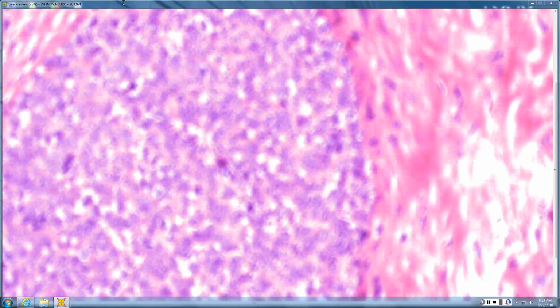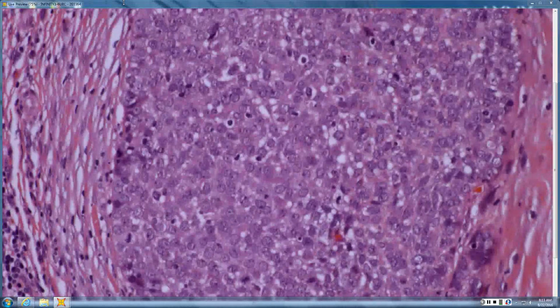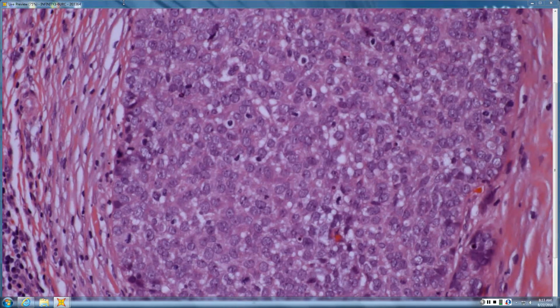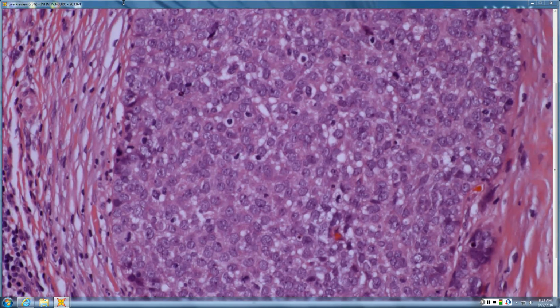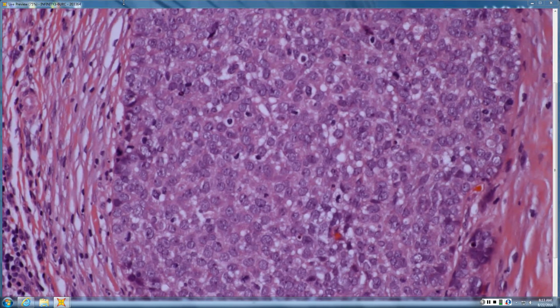Pretty large dermal tumor. I feel like a lot of pleomorphism and hypercellularity. Lots of mitosis, lots of visible nucleoli, irregularly shaped nucleoli with stems attaching them to the nuclear envelope, starfish-shaped nucleoli, very high nuclear cytoplasmic ratio. So you're pushing for something benign? Yeah, that was on the tip of my tongue. Yeah, so probably highly malignant, aggressive.